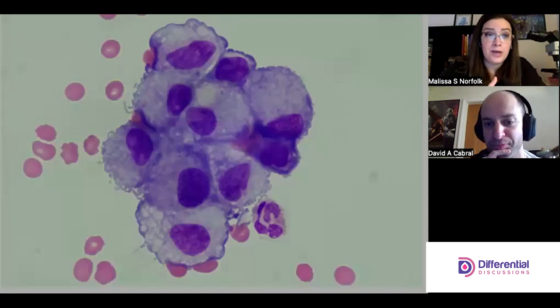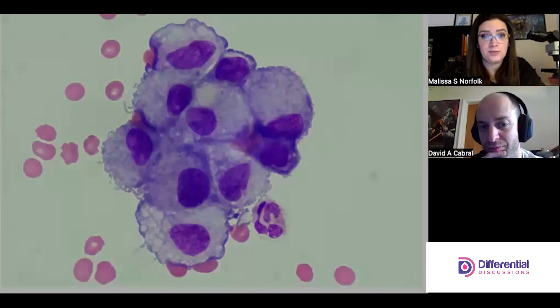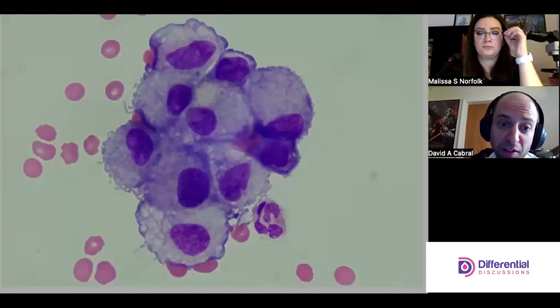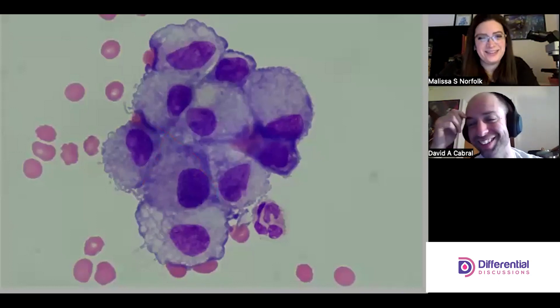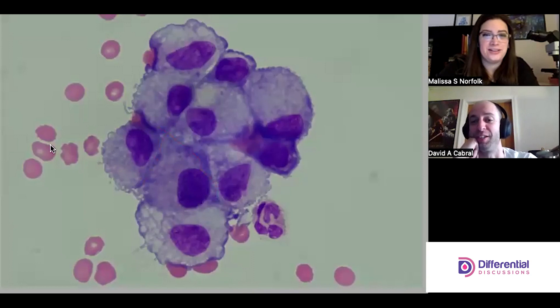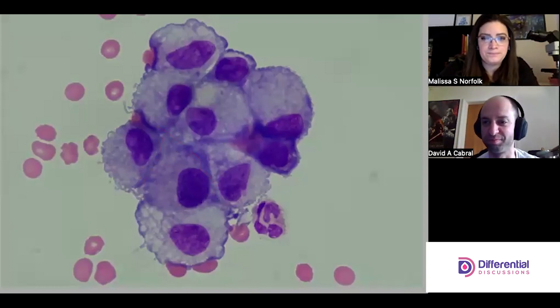But I will say I do like these as mezzos as compared to the first clump because I can see the windows more clearly here. Very true. So like we can literally just trace lines and we can draw, if I could draw, clear borders and boundaries. I can't draw either, but like if we're just following along them, you can really see the definition between each of them. Like I can even see that this one squeezes in here and then kind of comes out a little bit. Like you can really see the defined borders here. Yeah, I agree, it's a good thing.